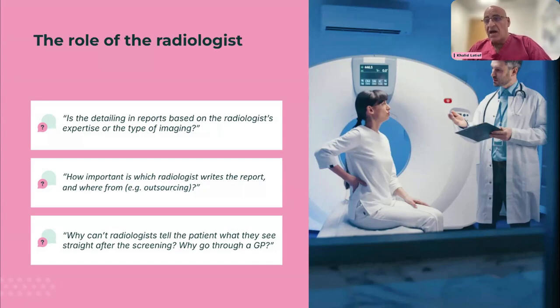There are some patients, however, who don't want to know. So you've got to make sure you don't tell that patient what's wrong with them because they're scared. But most of the patients are very happy to know what's going on while I'm ultrasound scanning them. I tell them straight off, and then I say to them, "This is what I will tell your GP. I will send the report to your GP, and I will tell them what I found." They're really very grateful for that information.